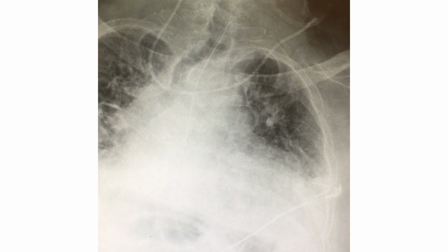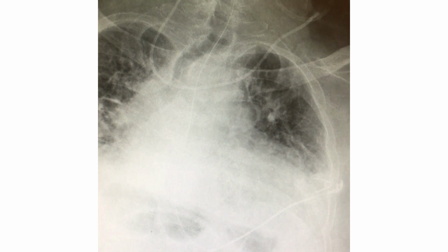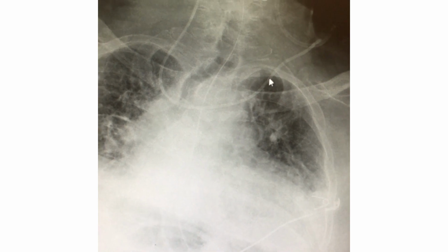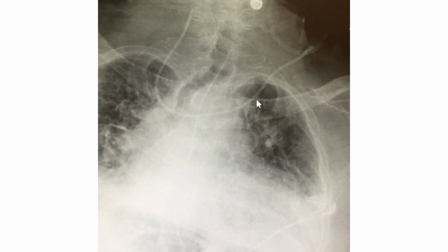Hi guys, so today we have a very interesting case. We did a central line on this patient. However, as you can see, the central line went in from the internal jugular and the course is kind of strange. So let's take a look at the anatomy.